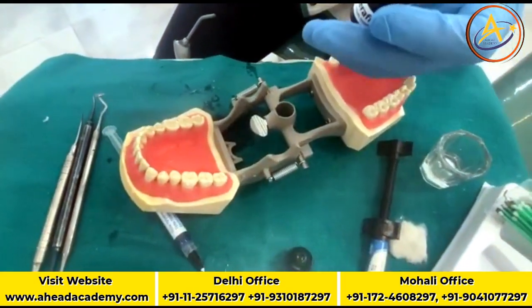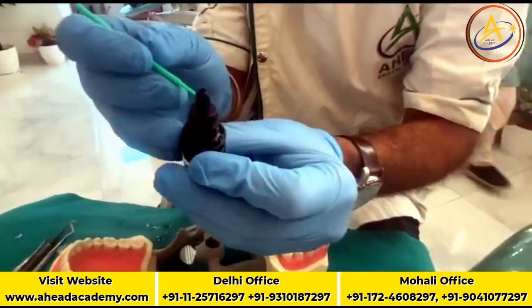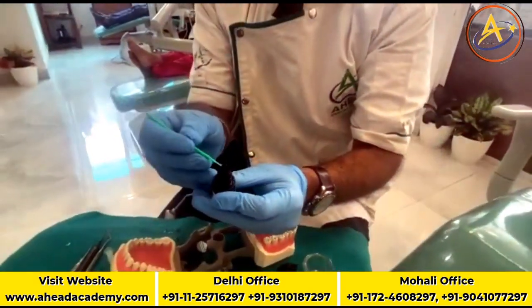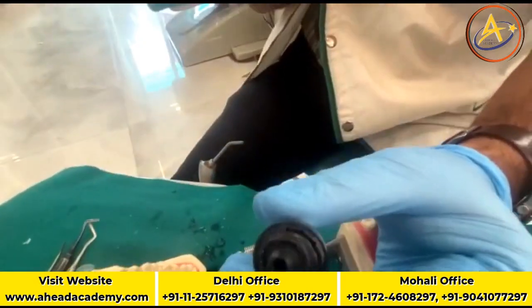Some of the operators, what do they do? They take the bonding agent from the sides. Please do not do this thing. Because what will happen? They just take the bonding agent from the sides and apply it on the surface. This is not right.